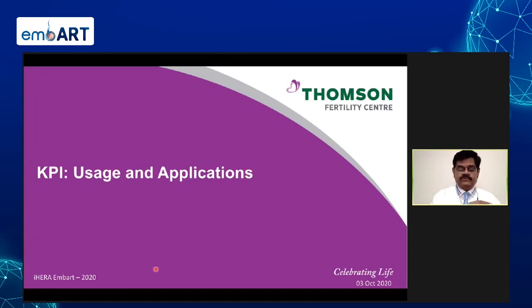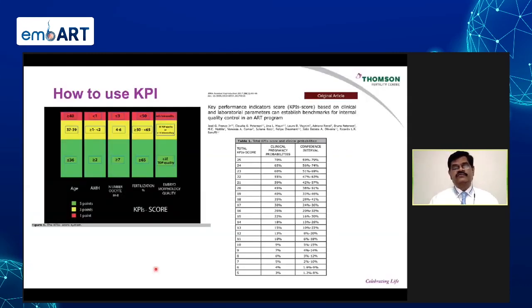What happened in the lab? So go and look at anything changed, any consumable changed, or any new staff has joined, so things like that. And later, you slowly spread this, and then your analysis should extend to the clinical side, where what kind of drugs, which batch was used, what's the average age of patients, and what kind of patients you treated during this time, right? And KPIs can also be used and applied in different ways.